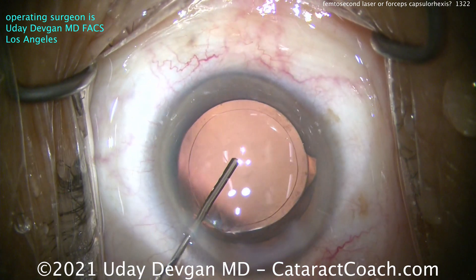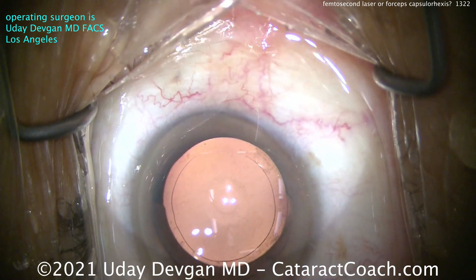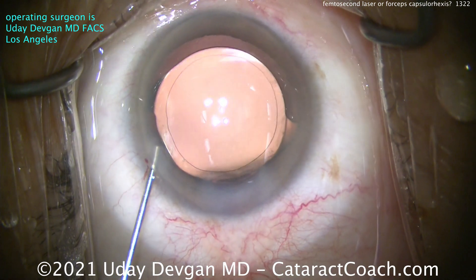But you've got to improve your hands — surgeon hands play a big role here. In novice or beginning surgeon hands, femtosecond laser may be more reproducible. But for an expert, it really doesn't make a whole lot of difference.